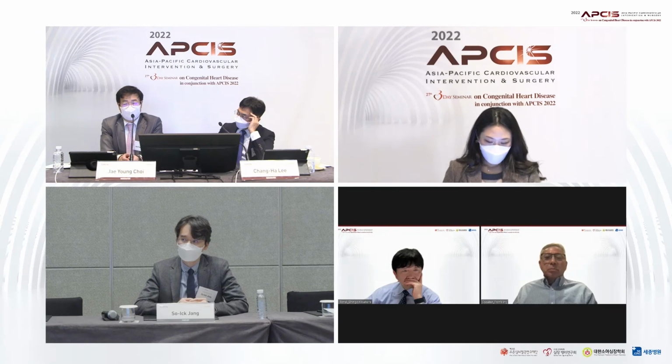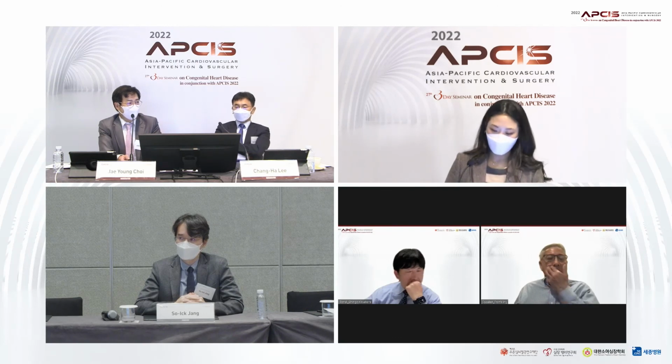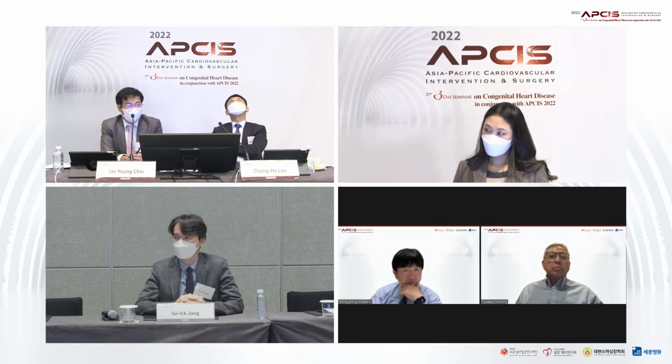Even though you try simultaneous ballooning and simultaneous deflation, the timing is not exact, since you don't have very accurate simultaneous work with two assistants. So sometimes you need to readjust the size of one side of the stent. I think it is reasonably done.